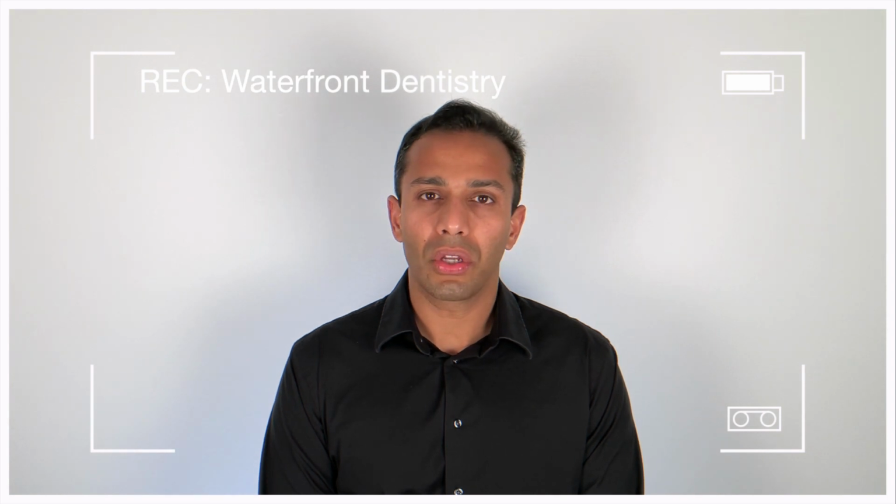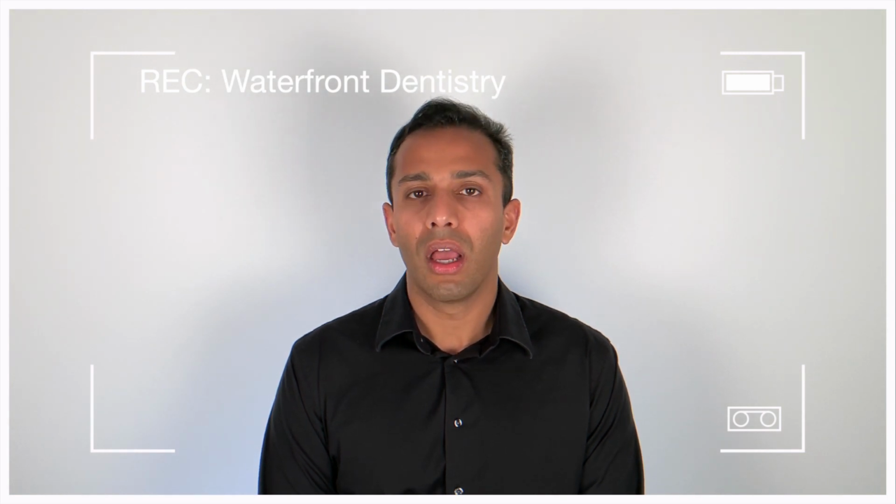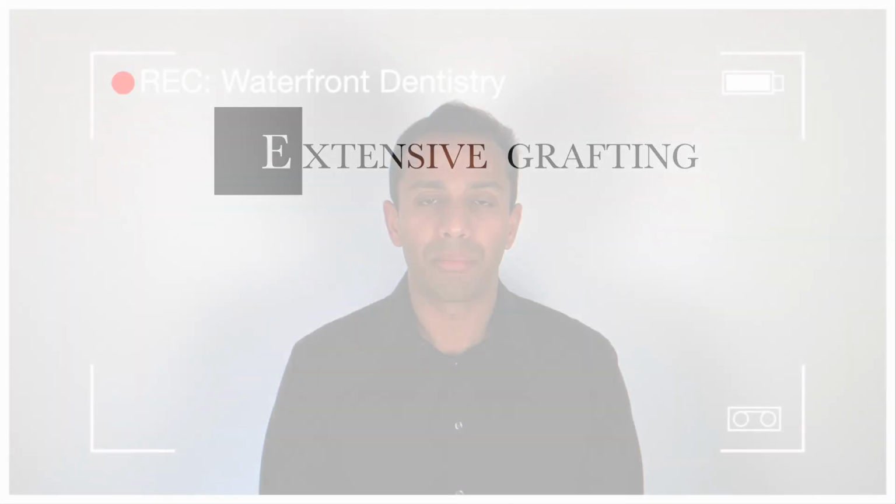So today I'd like to talk to you about what happens when you don't have enough bone to have implants inserted. So let's talk about the more extensive bone grafting needs or necessities. So the first thing is the sinus lift procedure.